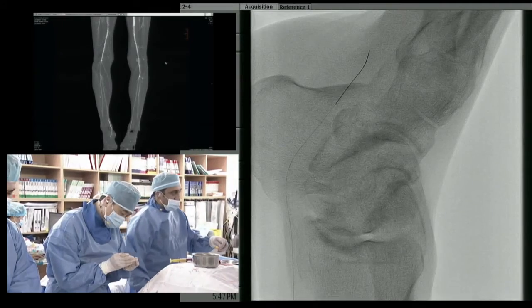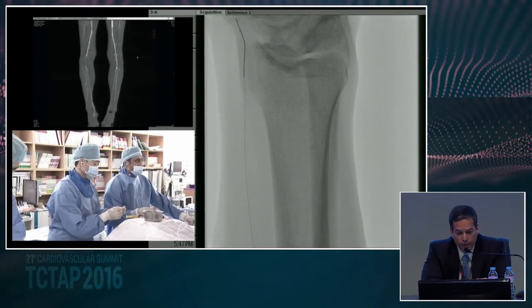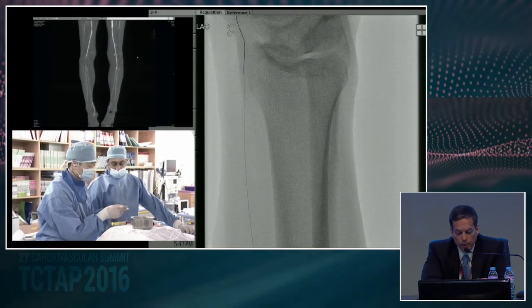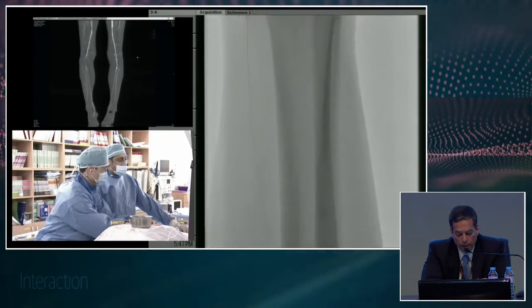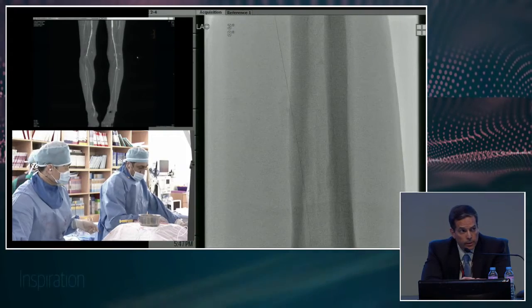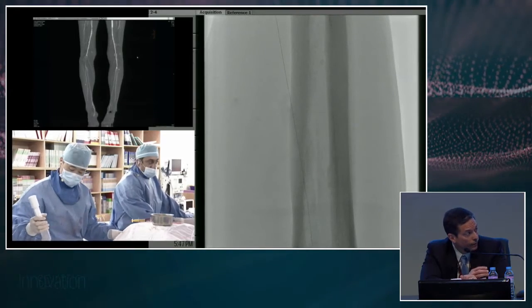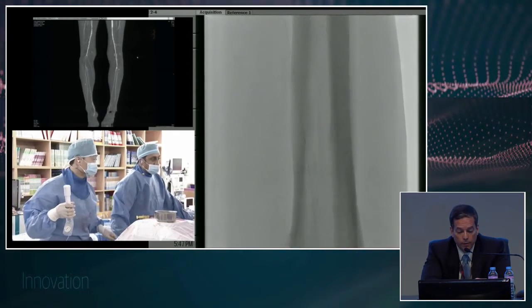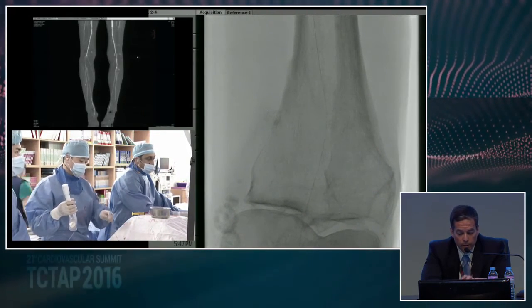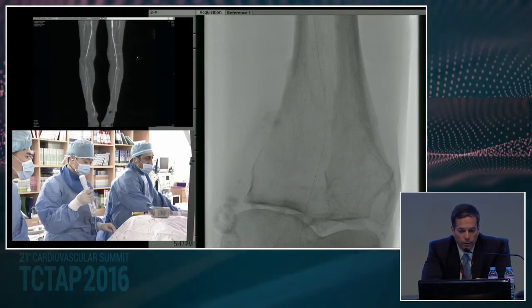I think you have a couple of options. You could do atherectomy and DCB. It was 5 years between occlusions, and that may give you the bang for your buck that it'll heal. The alternative would be a stent approach, and for that location, an interwoven nitinol stent such as a Supera may be a good choice. The problem is Supera has an OD that's non-tapered, 4.5 at the smallest and 6.5 at the biggest. Going across the tibial plateau does become a little more challenging, but it's still a possibility, and it should eliminate the idea of fracture there.